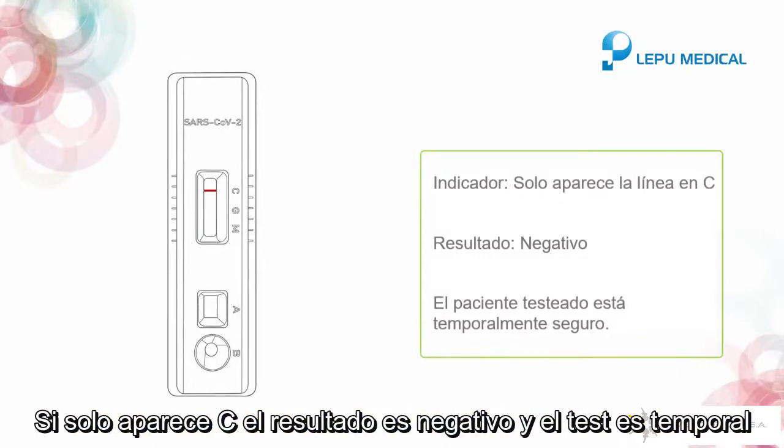If only the C line appears, it indicates negative, and the tested person is temporarily safe.